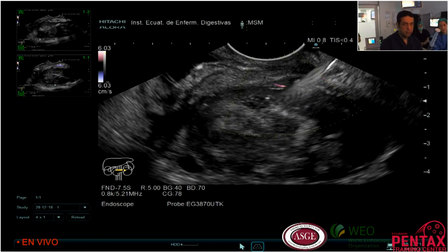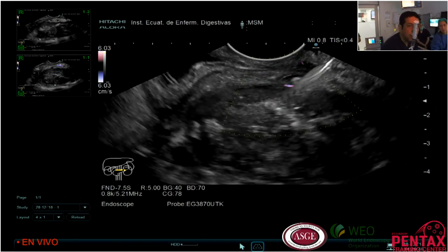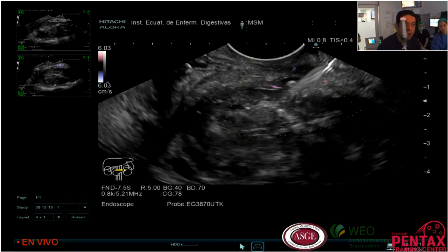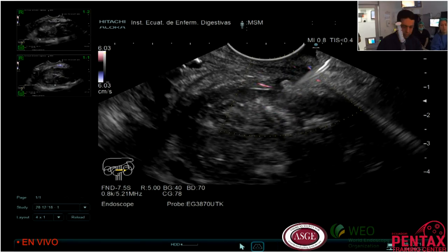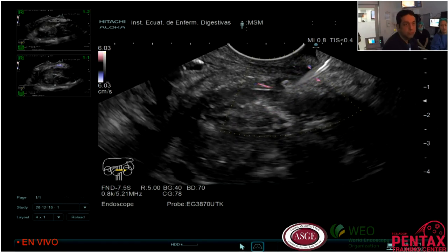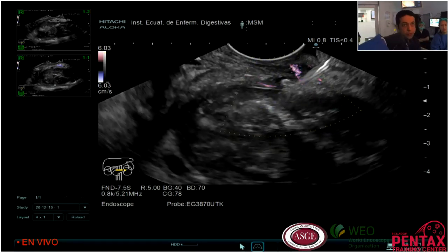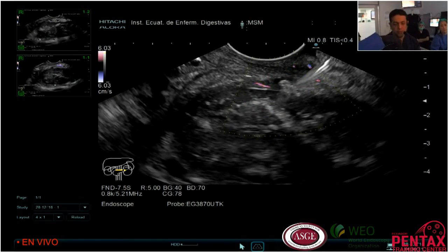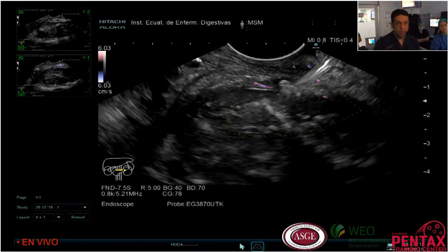I think that we are very well. Okay, give me the guide wire, please. So I will pass my guide wire inside. I don't see very well, but I don't want to change my position. I am sure that I'm inside. We need to use antibiotic prophylaxis.